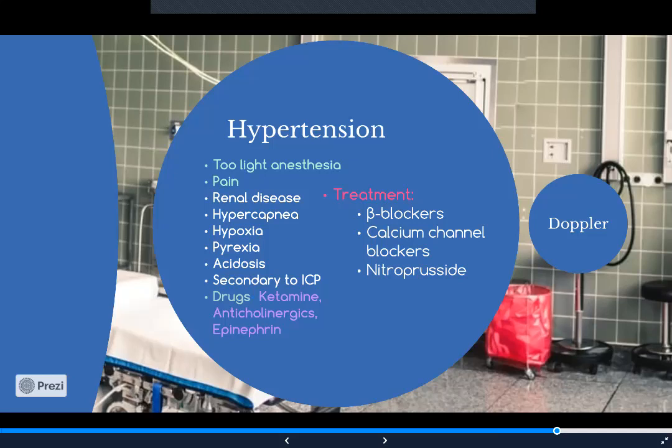And so what's happening is that the animal is taking back all of this carbon dioxide from the animals that have previously been in surgery, because there's too much carbon dioxide. So the end-tidal carbon dioxide level is high. And that's not fair. What you're doing at that point is suffocating the animal to death, and that's a way that we essentially can euthanize animals. We have to be really careful and change out the soda lime pretty regularly.